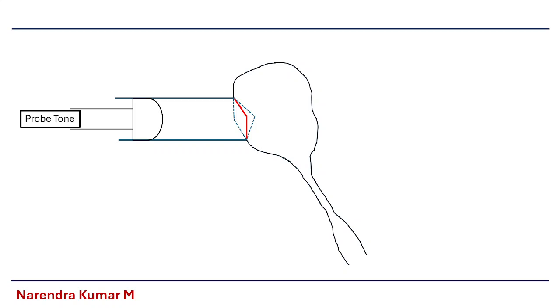The tympanic membrane usually vibrates within a boundary of free movement. So the disconnected line shown in the image depicts the maximum extent at which the tympanic membrane can vibrate. During this vibration, the sound from the ear canal enters into the middle ear space. If the tympanic membrane is not vibrating, or if it is more stiff, or the compliance is reduced, the sounds will get reflected back into the ear canal space.